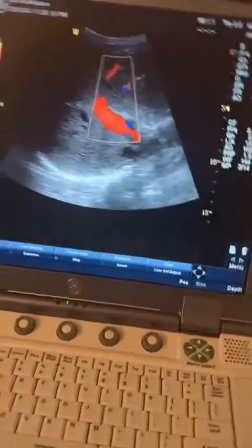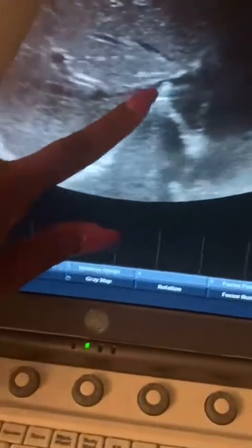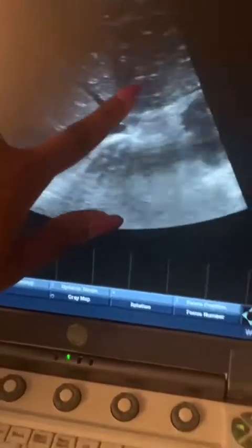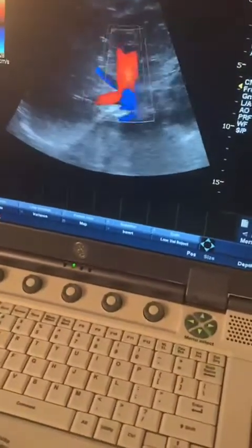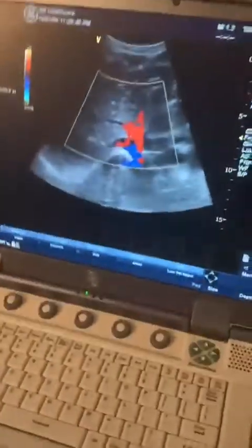I'm going to freeze and take color off. The next thing is to look at the hepatic veins. Deep breath in and hold it. You can see the approach for the hepatic veins — on that image I have my right hepatic vein, the middle hepatic vein, and the left hepatic vein, all from that view. When I put color on it and make my box a little bigger, you can see all three from this view.